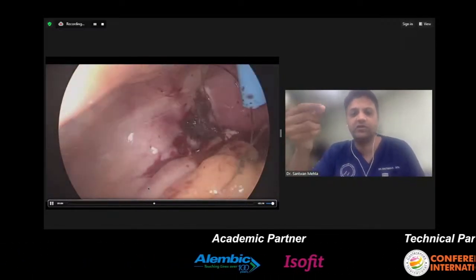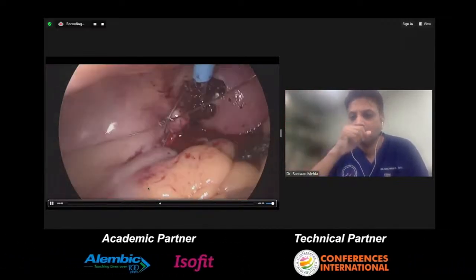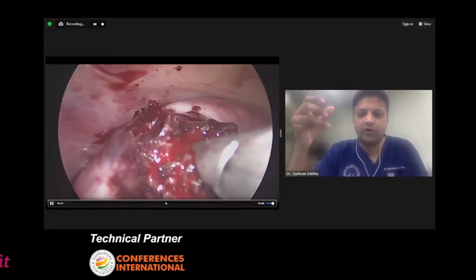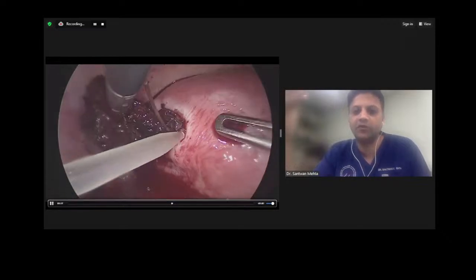This is the same loop which surgeons use for the appendectomy. Now I am applying the loop at the base of the ectopic mass in order to achieve hemostasis and cut off its blood supply from the uterus.